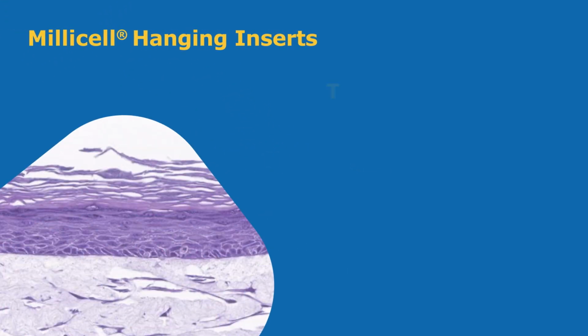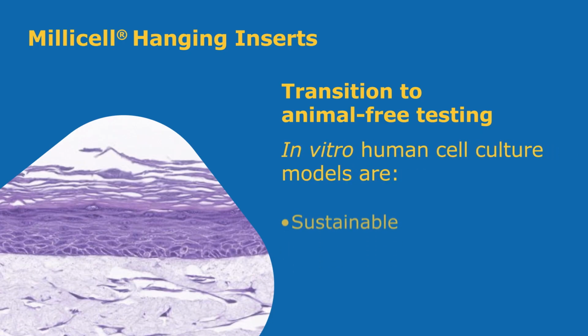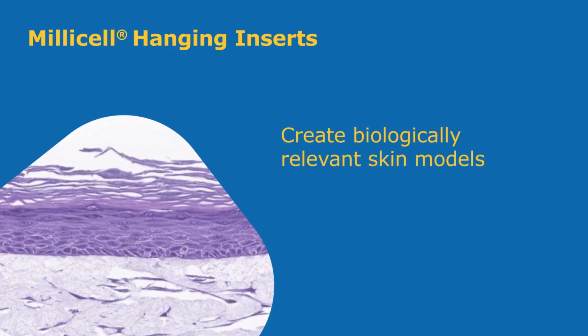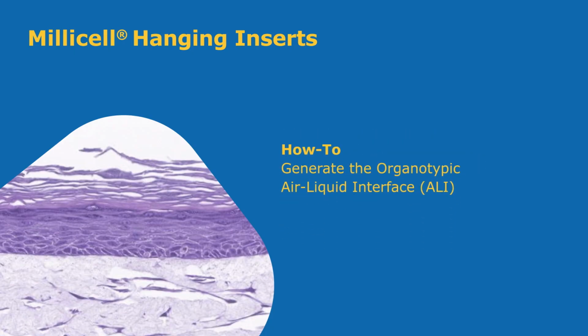As researchers transition to animal-free testing, in vitro human cell culture models are a sustainable, effective, and reliable solution. With the Millicell Cell Culture Insert, you can create biologically relevant skin models. In this video, we will show you how to generate the Organotypic Air-Liquid Interface, or ALI, 3D skin cultures.